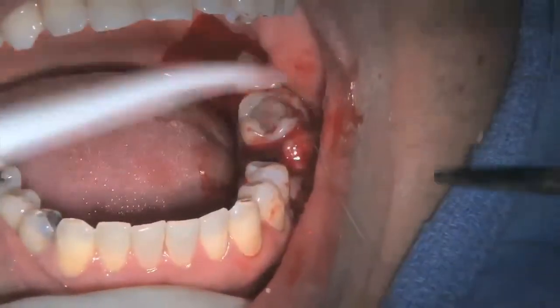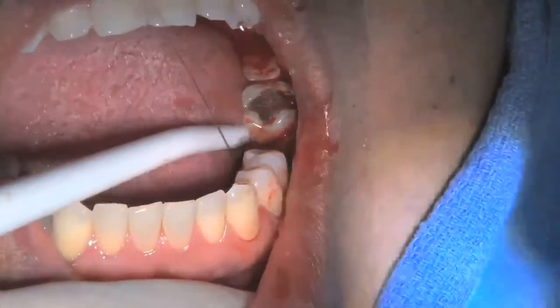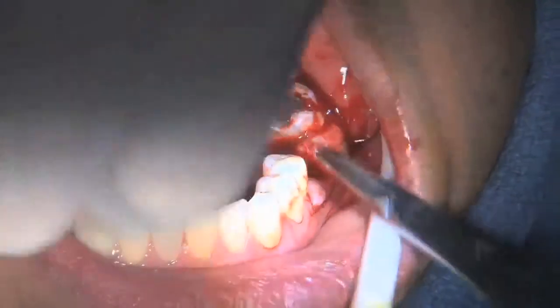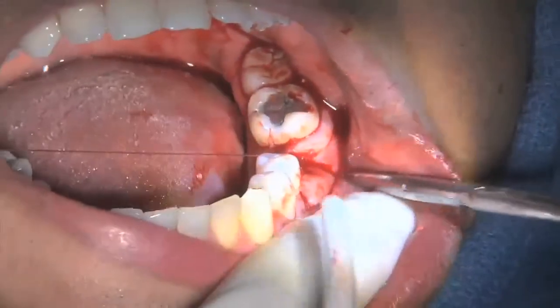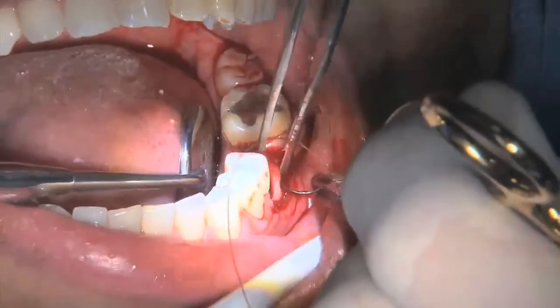Suturing is completed utilizing a 4.0 chromic suture. The use of the 4.0 chromic is good for 5 to 7 days. Sometimes in some mouths it will go even longer. And it will eliminate the need for suture removal at a later date, which can be uncomfortable for the patient and time-consuming for the dentist.